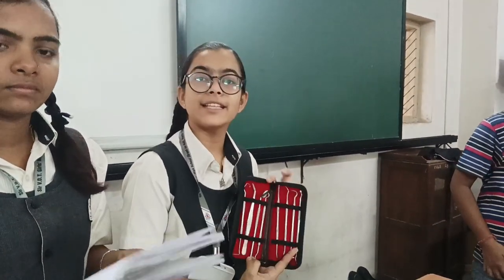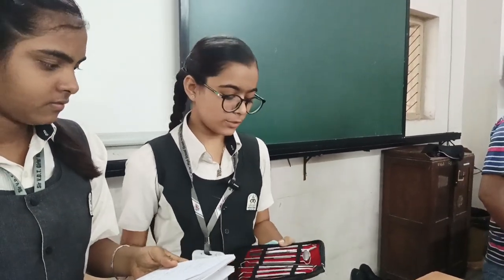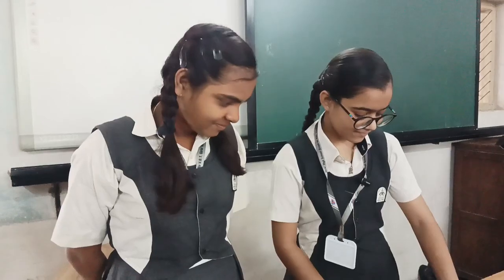Today I am going to explain the dentist kit, instruments and all the tools. Okay, so she is my patient. Patient is very happy.